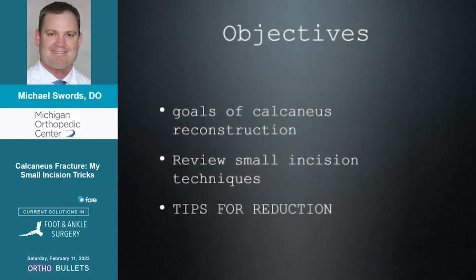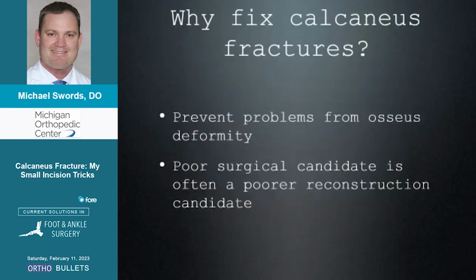The objectives for this really are to talk about the goals of calcaneus reconstruction. We're going to review some small incision techniques, and I'm going to talk about tips for reduction. These are universal tips to whichever method you're using for fixation. So why do we fix them?